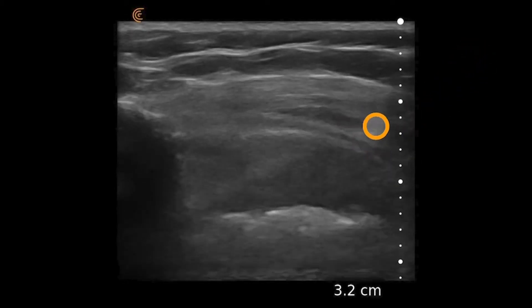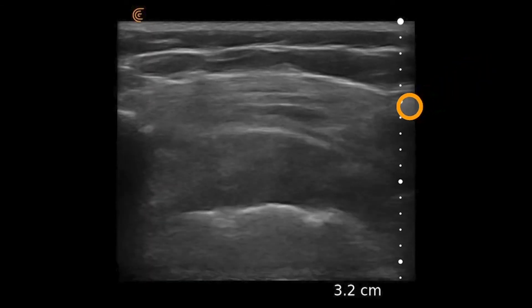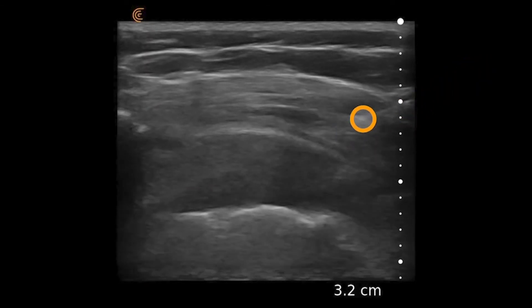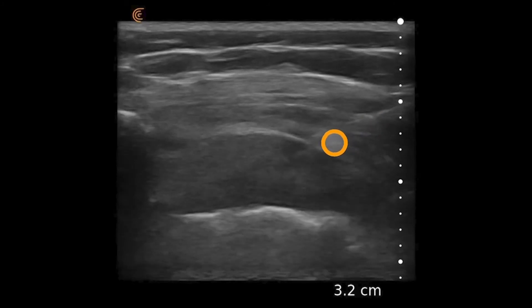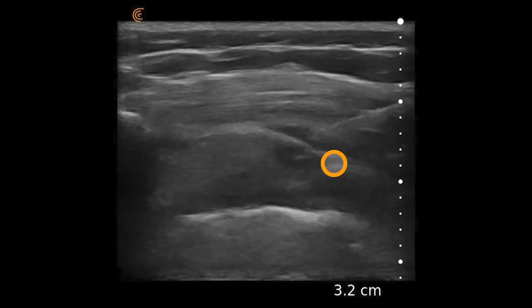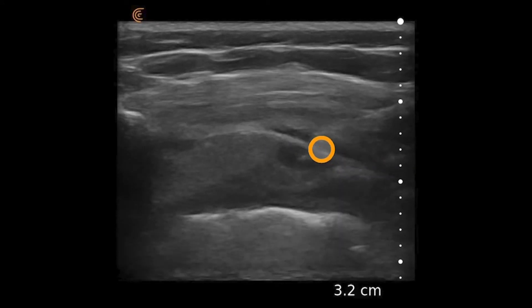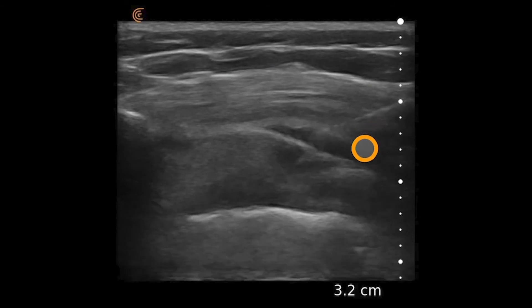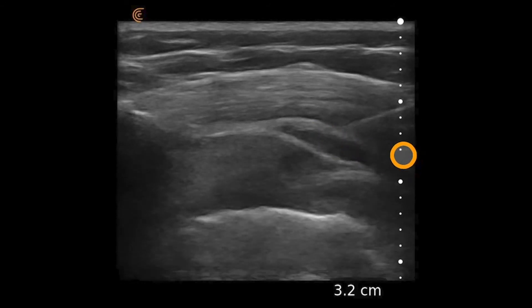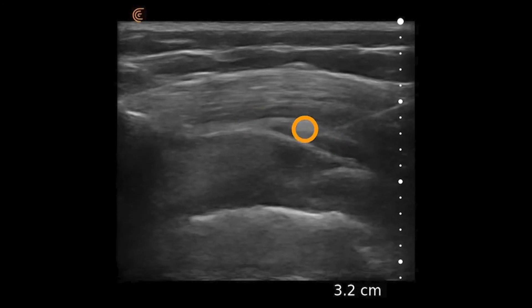Under direct ultrasound guidance, a small 25-gauge needle is seen coming in in-plane. With first a test dose and then entering into the subacromial bursa area, you can see that tiny space expanding between the rotator cuff and the deltoid muscle — now expanding with steroid being directly injected into the exact space of what appears to be a thickened subacromial bursa, in this patient who presented with impingement symptoms.